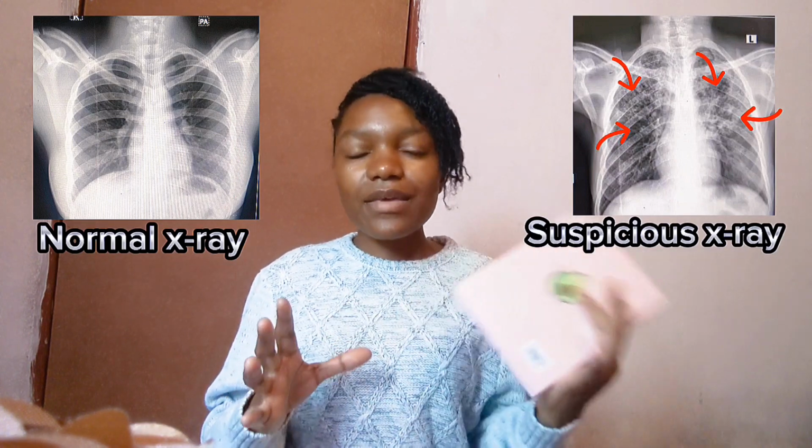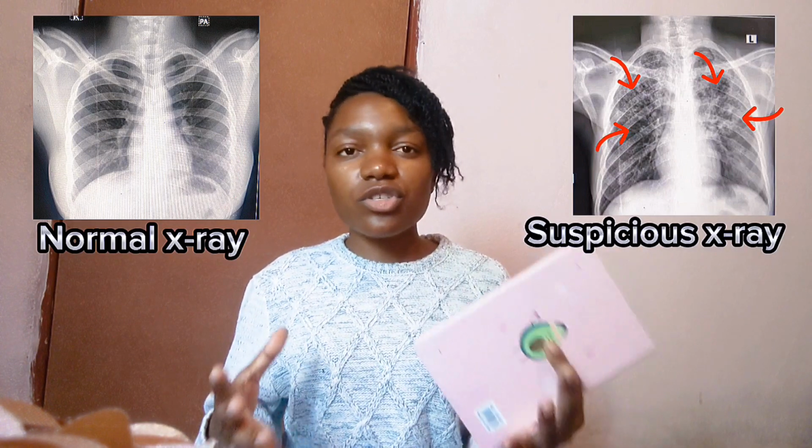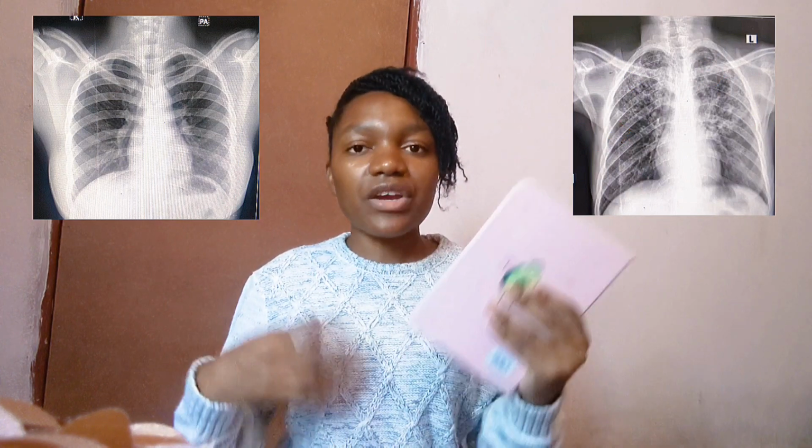So understanding the x-ray image and all that, you first have to understand how they interact with matter, or how they interact with the patient's body or an object, right? So this is what I thought of sharing with you guys about understanding the x-rays, so that you will be able to understand what really goes on in the department. Or when you go in a radiology department, they tell you, okay, we have to do this, you have to remove these kind of things that are not necessary. You get to understand that.